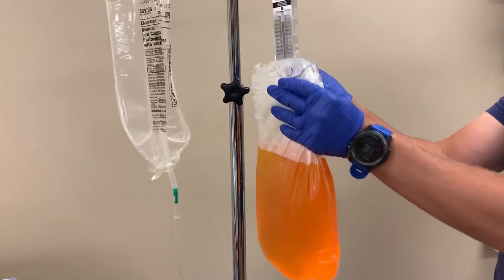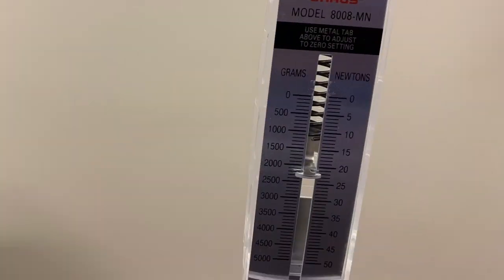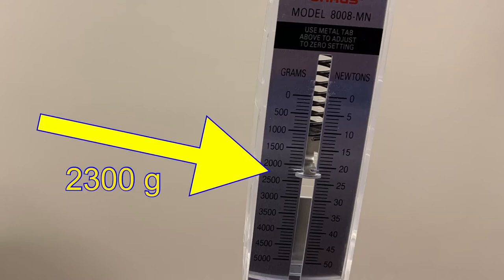In order to measure the amount of fluid that was drained from the peritoneal space, we'll need to weigh it. You can use the spring scale we ordered from CSPD. We can see that this bag weighs 2300 grams. With the metric system, we know that one milliliter of water is equivalent to one gram. So if we have 2300 grams of fluid, that is equivalent to 2300 milliliters.